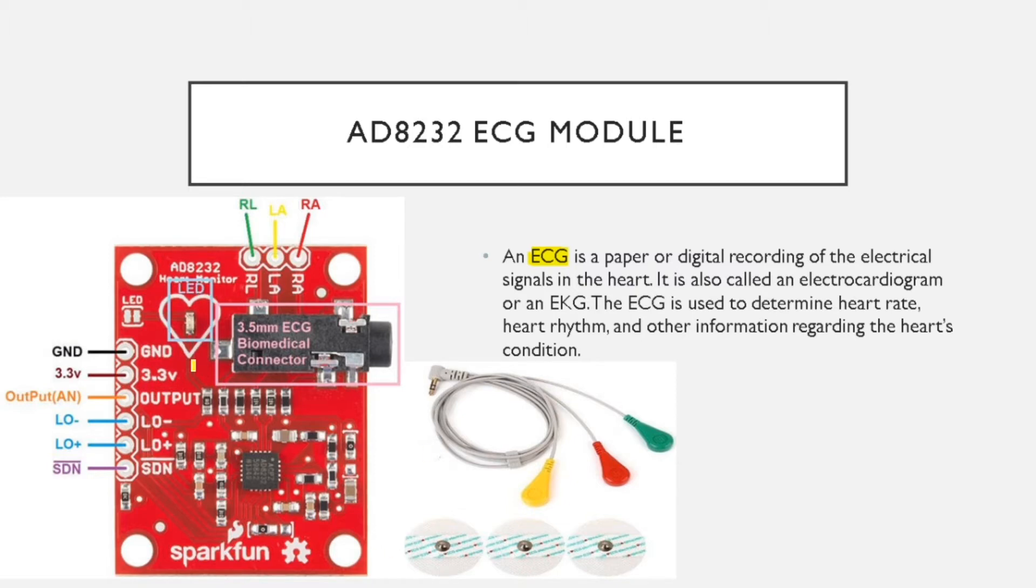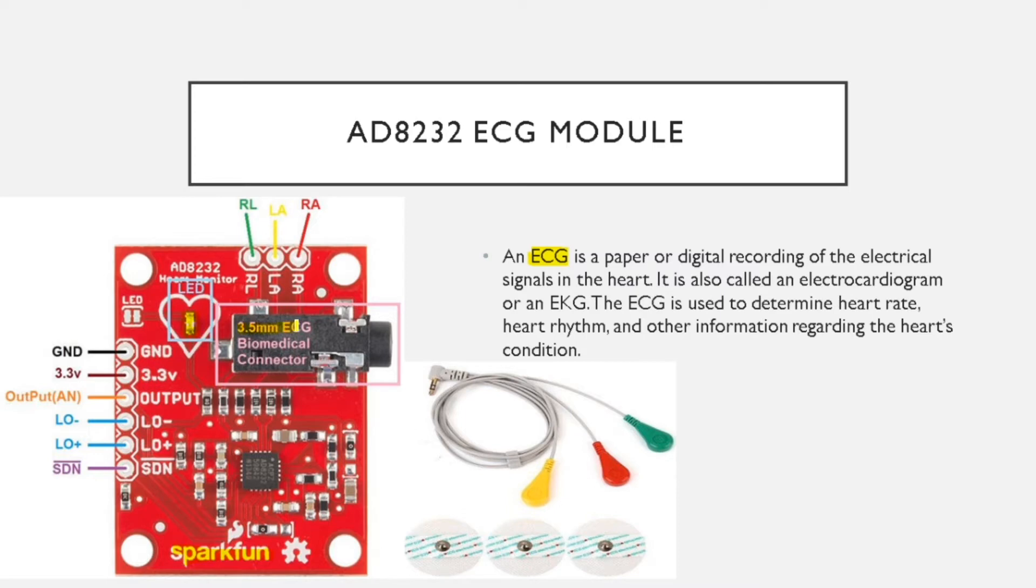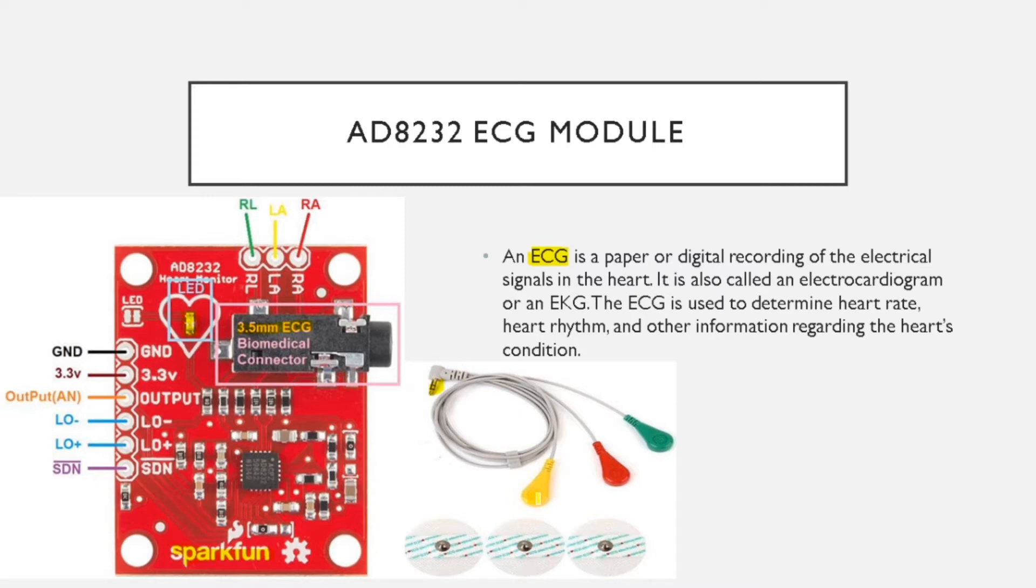So this is the ECG module that we are going to use in this project. It is made by SparkFun and it has an LED over here and a 3.5mm ECG jack. This pin has to be connected over here and it is a 3-lead ECG, and these pins are to be connected to the ECG pads.